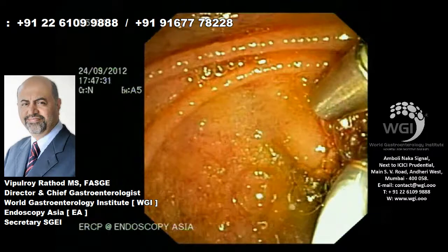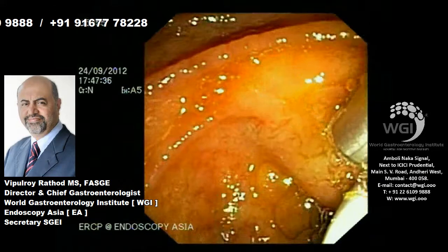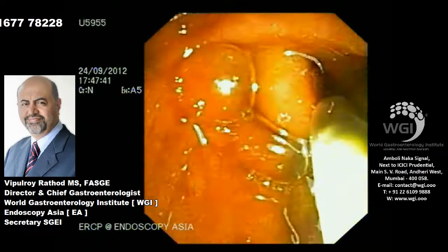And there was a little bit of oozing because of passage of the balloon. So we are injecting on the left of the stent and the apex of the sphincterotomy to make sure there is complete hemostasis.